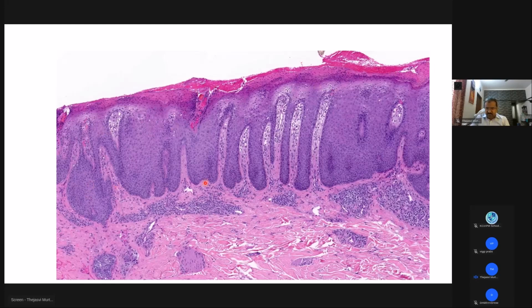Here you see regular epidermal hyperplasia, elongated rete, thinned out suprapapillary plates. This is psoriasiform acanthosis. So you classically see psoriasis with all the associated features, confluent parakeratosis, etc. We will derive an algorithm for this also.